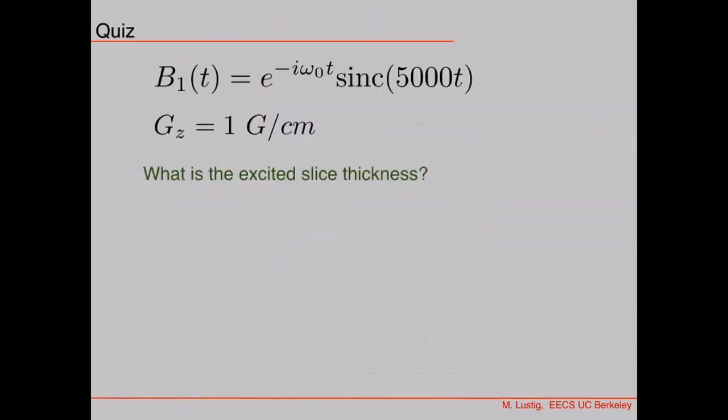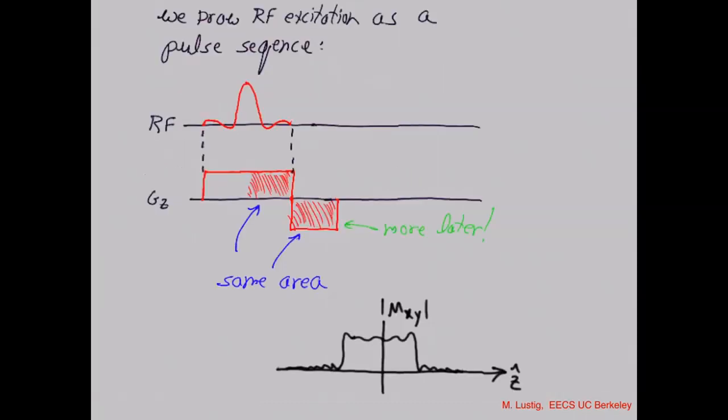All right. Professor, quick question. So in the previous slide, you had MXY. Are those all the same just because in the XY plane, they're all excited the same amount? Yeah, so MXY is a transverse component, and I'm looking at the magnitude across the transverse component. So it's the square root of MX squared plus MY squared. That's what I'm looking at.